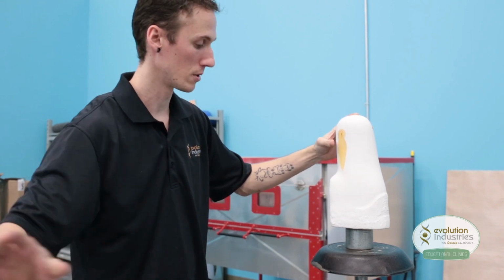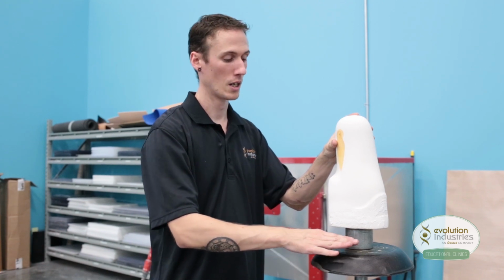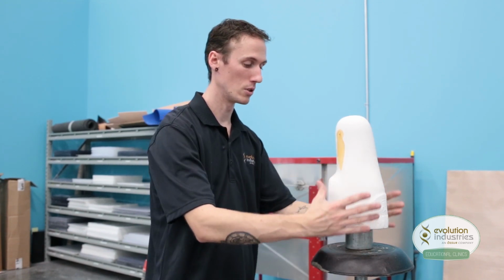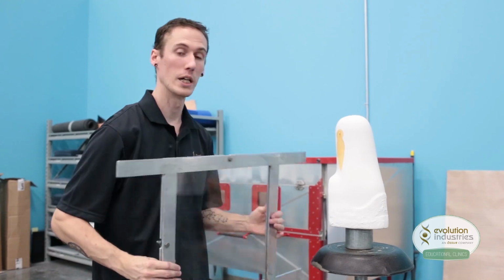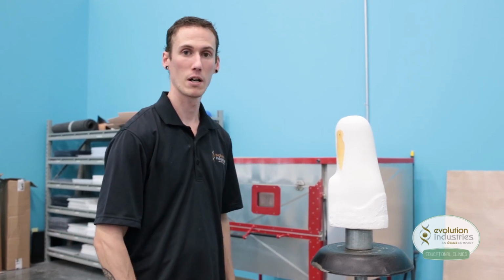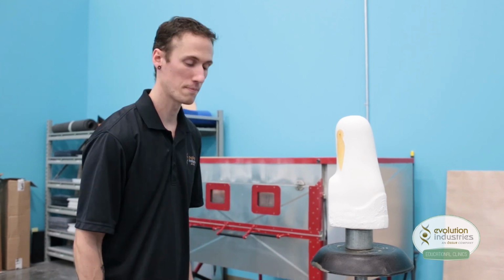You can use PVC, anything that will resist the heat of the plastic, and you elevate it off the plate. That way, if you start to get any wrinkles, you can sweep them down underneath, giving you a nice flat surface. So we heat our 1/8 inch PETG at 375 degrees Fahrenheit. I will heat it for 1.5 minutes, turn it over for 1 minute, and temperature and times may vary depending on which oven you use.